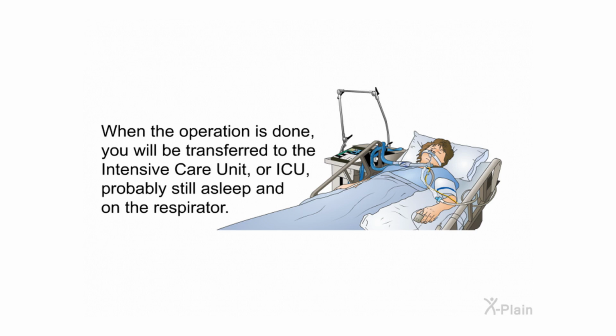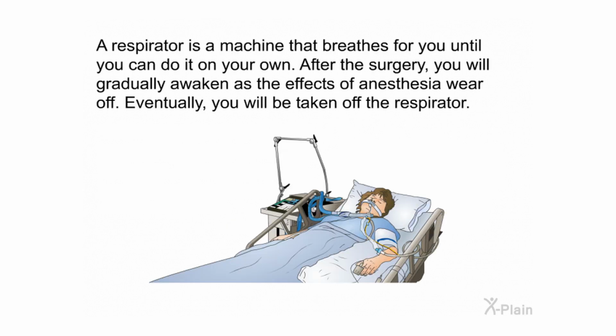After surgery. When the operation is done, you will be transferred to the intensive care unit, or ICU, probably still asleep and on the respirator. A respirator is a machine that breathes for you until you can do it on your own.